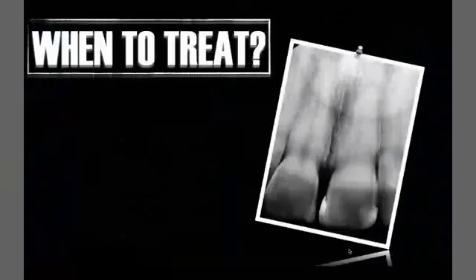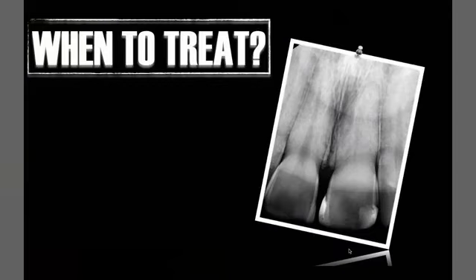Do you have any tips to increase the difference in terms of color between calcified tissue and dentin? Yes, sometimes we can use the canal detector, maybe red fuchsin, maybe methylene blue, just to differentiate between the colors. But usually, when you dry the pulp chamber, and with a very high magnification, 16 or 20x, you will differentiate between the bright and the dark dentin.